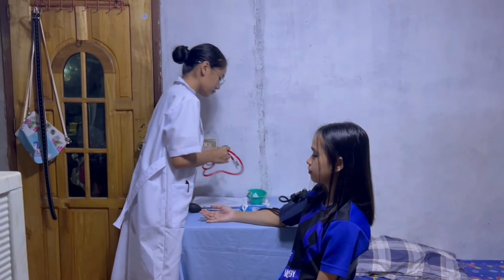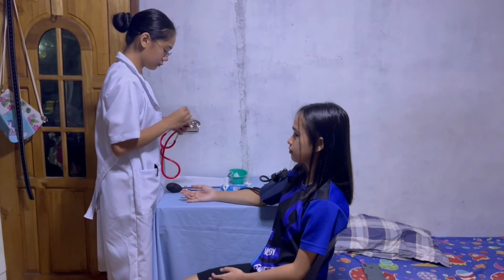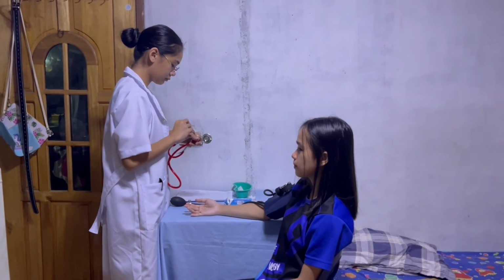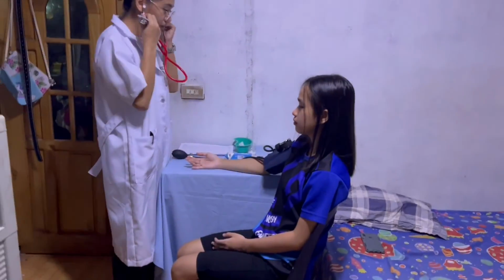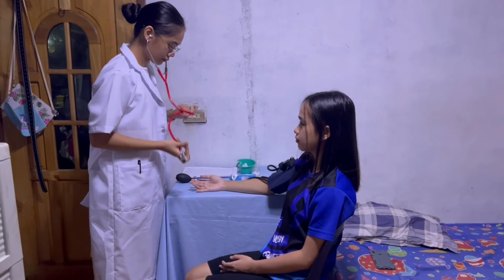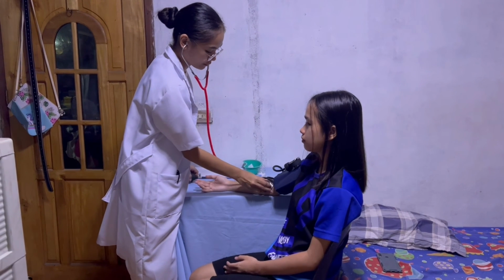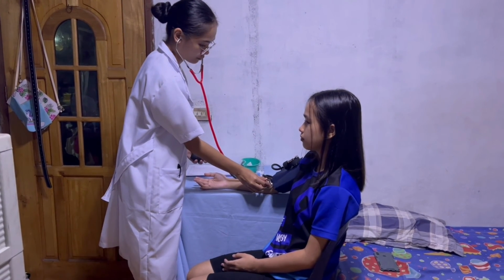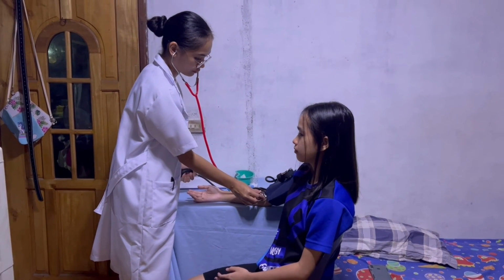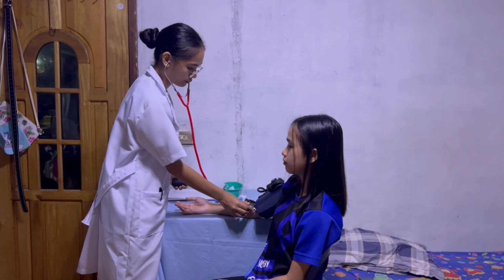Cleanse the earpieces with cotton balls with alcohol and insert the ear attachments of the stethoscope in your ears. Ensure that the stethoscope hangs freely from the ears to the diaphragm. Place the bell side of the amplifier of the stethoscope over the brachial pulse site. Place the stethoscope directly on the skin and not on the clothing. Hold the diaphragm with a thumb and index finger.